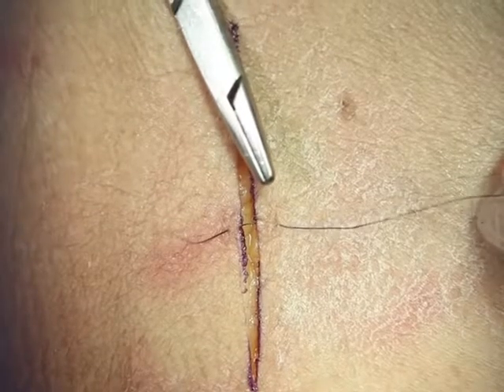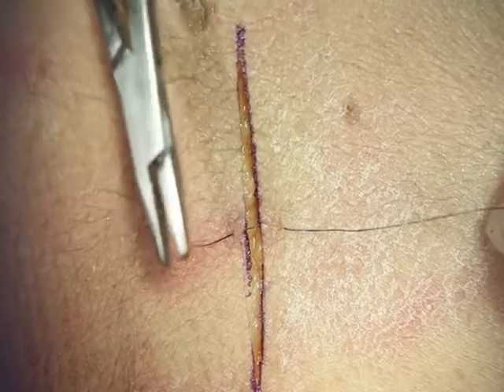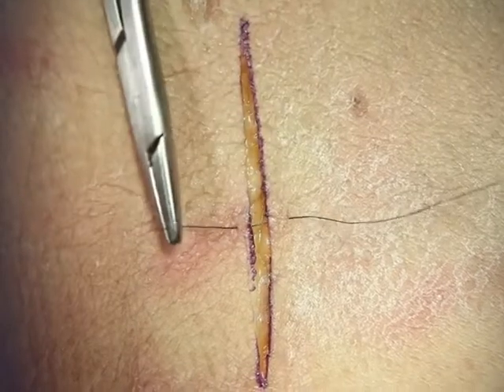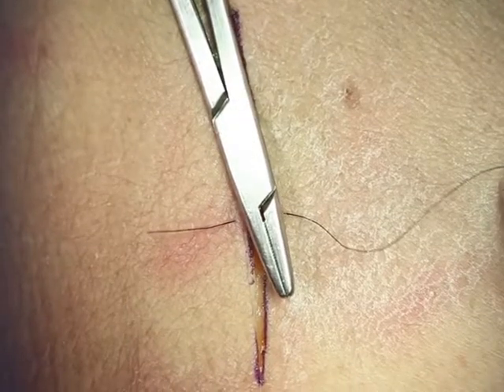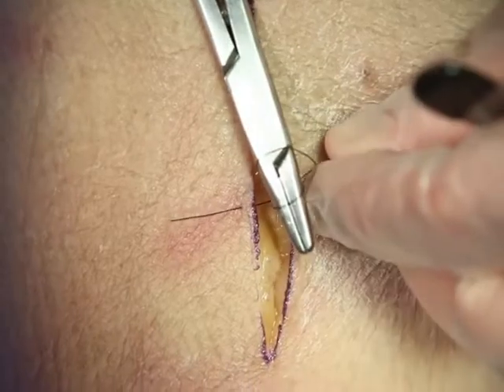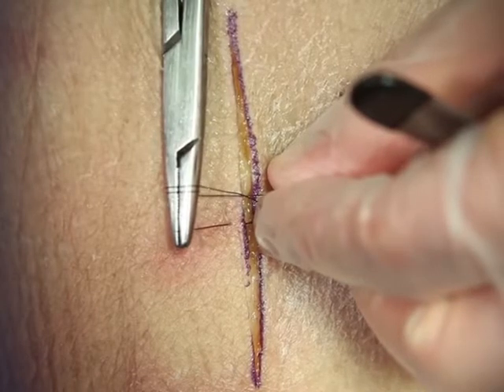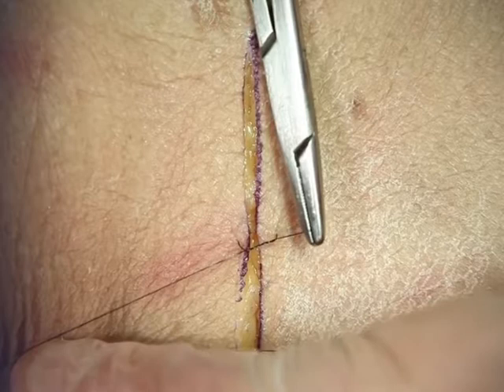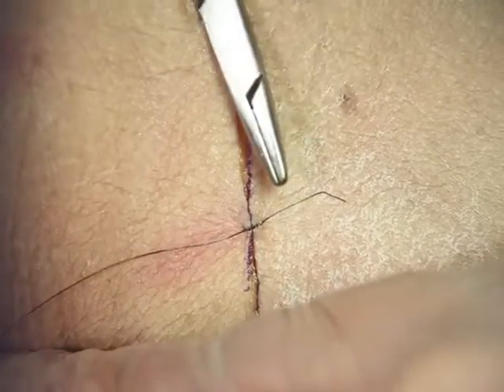Before we get started showing you different suture techniques, I want to show you a basic instrument tie. This can be used with any of the suture techniques that you'll learn. Once the suture is placed, you'll have a short end and then a longer loop end. Your needle driver should be placed directly between the two, and then we will do a surgeon's knot. You'll wrap the longer end twice around the needle driver, grab the smaller end, and pull it to the opposite side. When you pull it to the opposite side, it will square the knot.